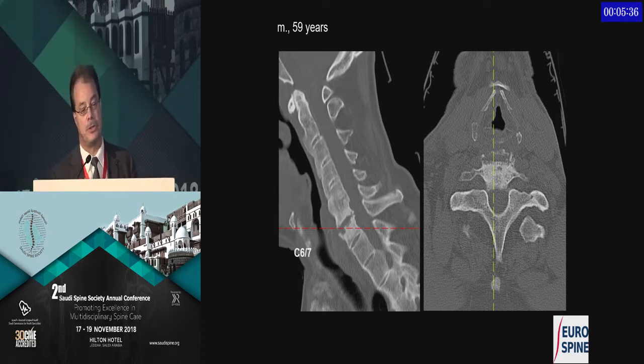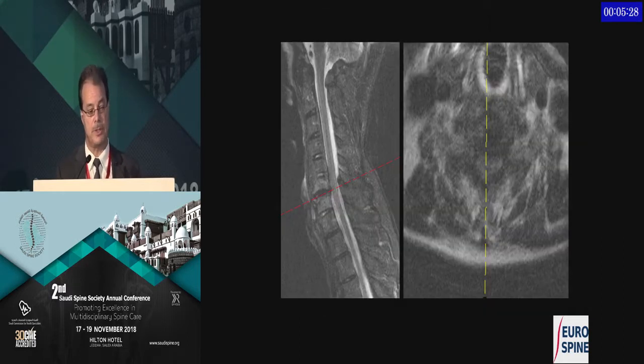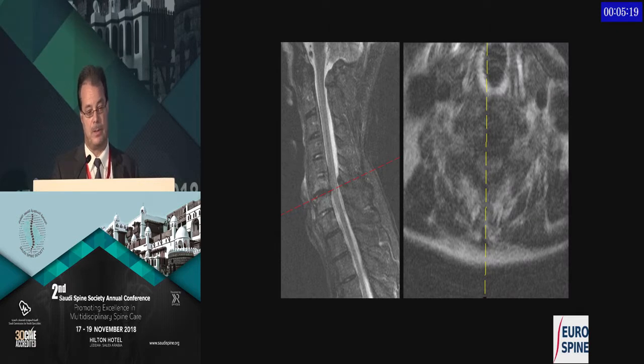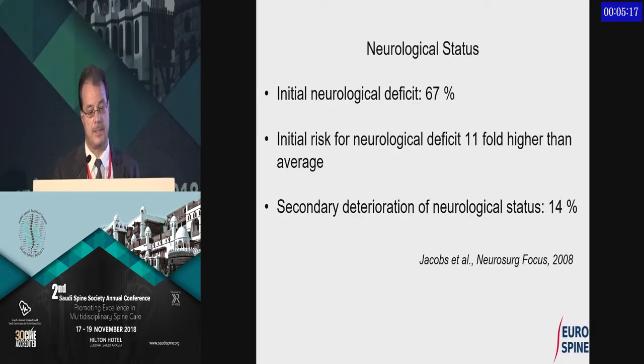He gained a little bit of lordosis. So one of the concepts would be to use that little bit of relordosis that the patient has, go for anterior stabilization, posterior stabilization, because these fractures are always pan-spinal fractures, and this is the corresponding MRI scan.